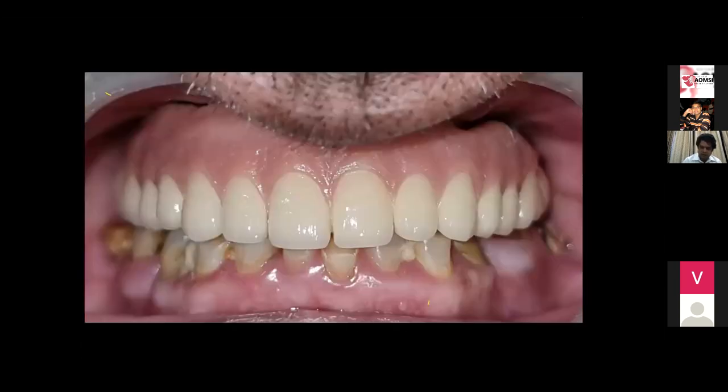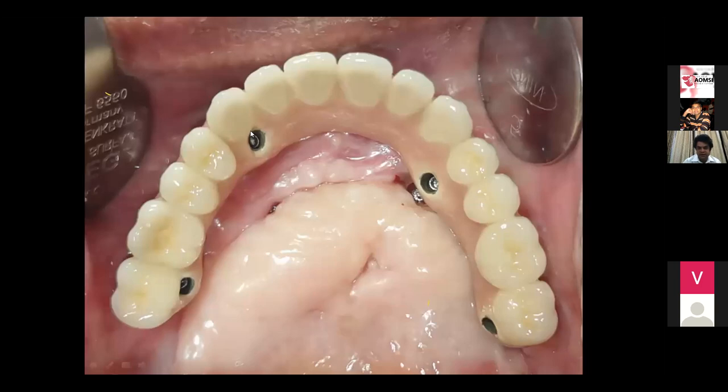I always like to bring your attention to this implant. See, this implant is in correct position. It has gone very anteriorly so that the anterior cantilever is minimized. Had this implant also been here, I would be very happy. So we should take care while placing the implant that the entire implant should come out as anteriorly as possible.